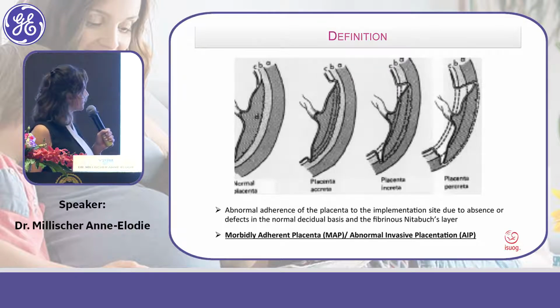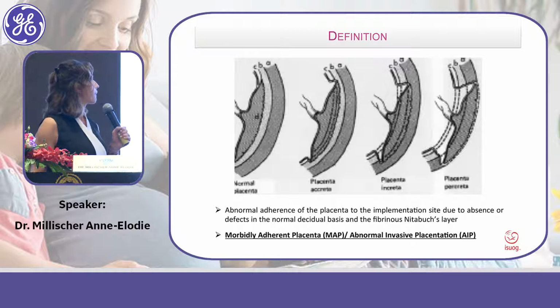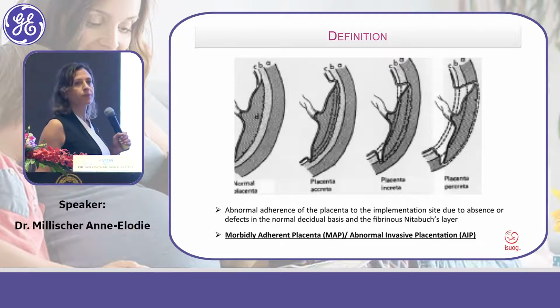Mình có thể dùng cái thuật ngữ này thay cho cái placenta accreta là tại vì cái nhau cài răng lược và có thể accreta nó chỉ là một cái giai đoạn ở trong một cái phần nhỏ ở trong cái nhau bám bệnh lý thôi. Placenta increta means that there is some invasion of the placenta throughout the myometrium without crossing the serosa of the uterus.